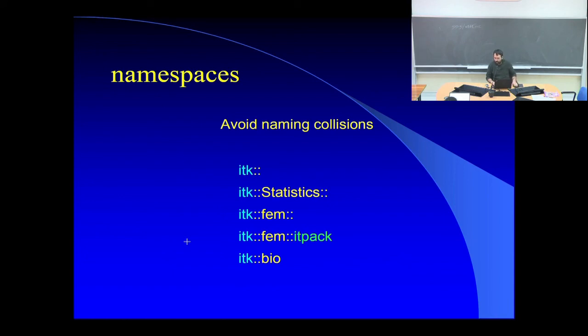So to avoid any problems, what we usually do is add the namespace explicitly to each of the classes that we have. Okay. That means if it's an ITK class, we'll use itk, double colon, and the name of the thing we're using: itk::Image, itk::blah blah. Okay.